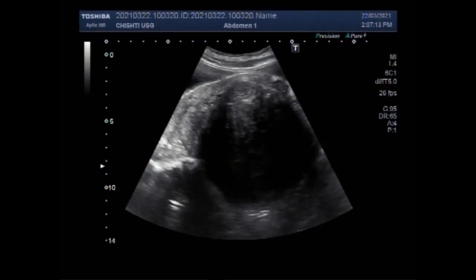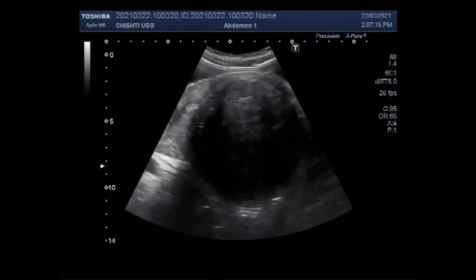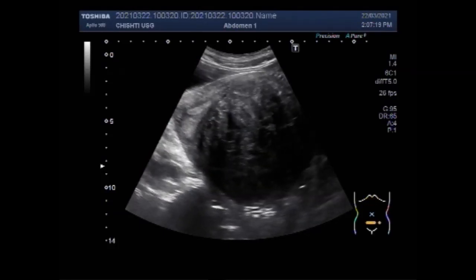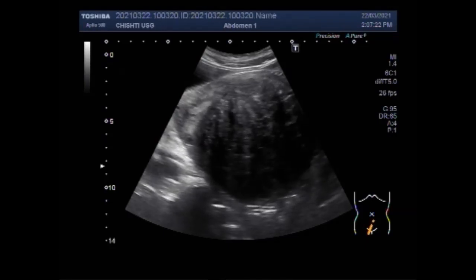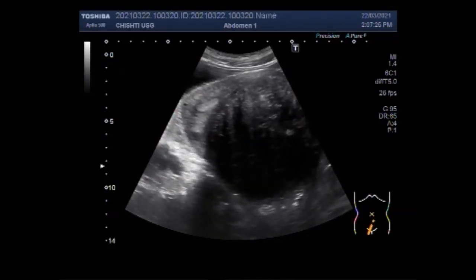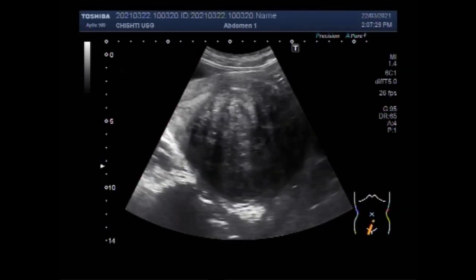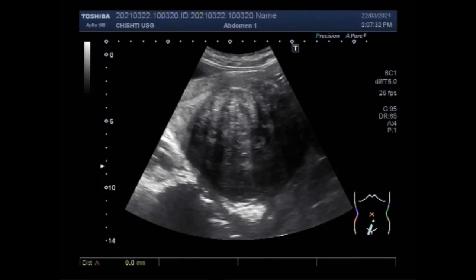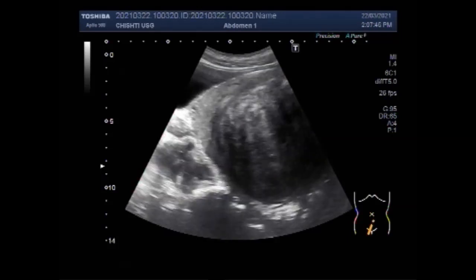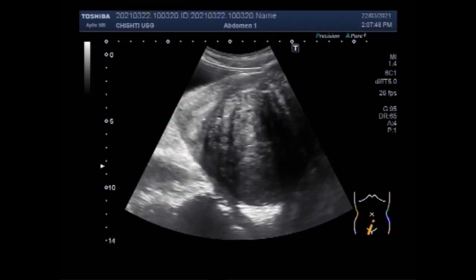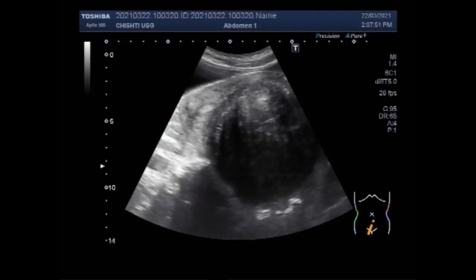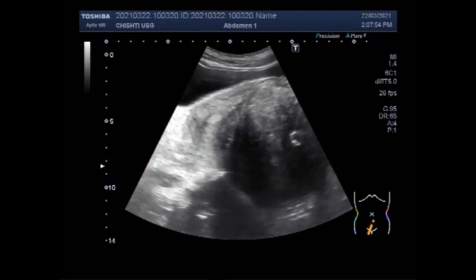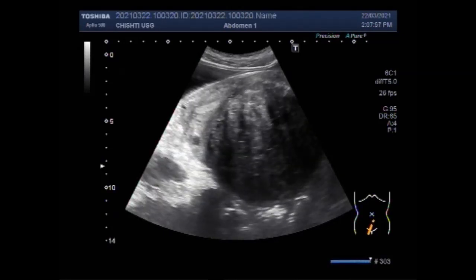Dear viewers, I hope you are all fine. This ultrasound video shows a large pelvic mass. Understanding a large pelvic mass is slightly tricky. You can see a large pelvic mass, and the mass is so large that the uterus and the ovaries are not properly visualized. You will have to scan for some time using different probe handling techniques to visualize the pelvic organs and find the origination of the mass.